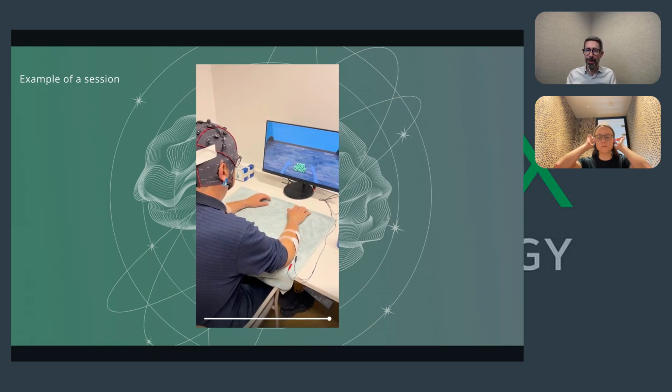Think conditioning, think dog training. Whenever the dog does something approximately right, it gets a treat. Over time, you make it a bit harder and say, it's not when you sit wherever, but only when you sit next to me or really on my foot that you get the treat. With recoveriX it's similar, the brain is learning. And as the brain is learning, it produces better results, and with that it also gets the reward in a better way. So we try to keep it interesting for the person, because sitting there repeating the movement so often, the person needs to be able to stay engaged.